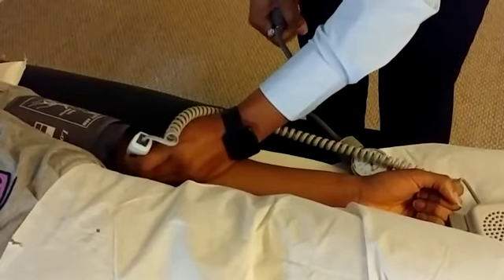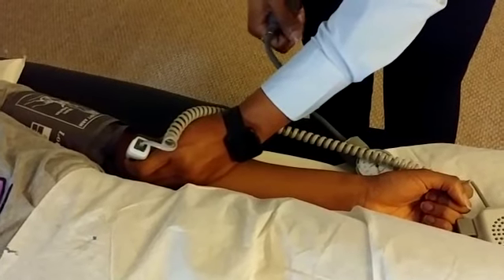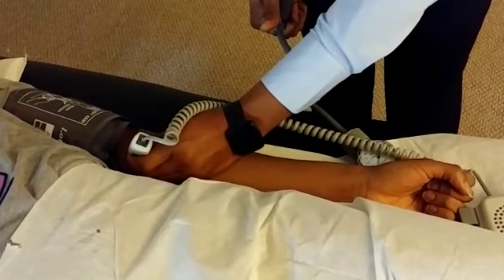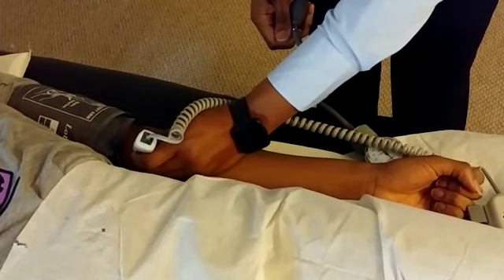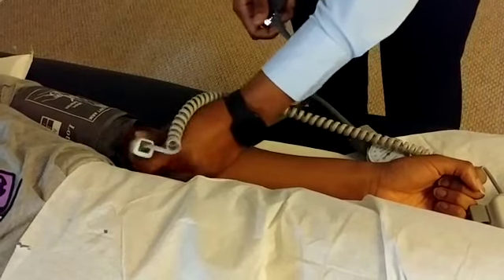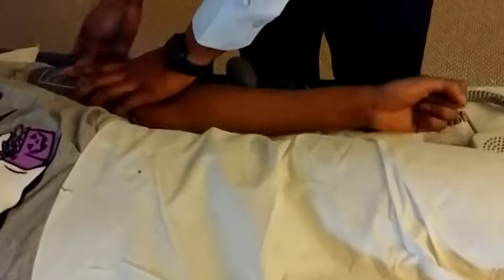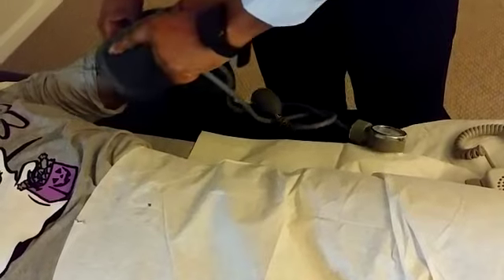I'm going to inflate the cuff until the pulse totally disappears. So if it disappears at 160, I'm going to inflate till about 190, and I'm going to slowly deflate. The first pulse, which was at 130, is her brachial pressure. So I inflate until the pulse disappears, then slowly deflate until I get the first pulse. So we have a left brachial pressure there of 130.